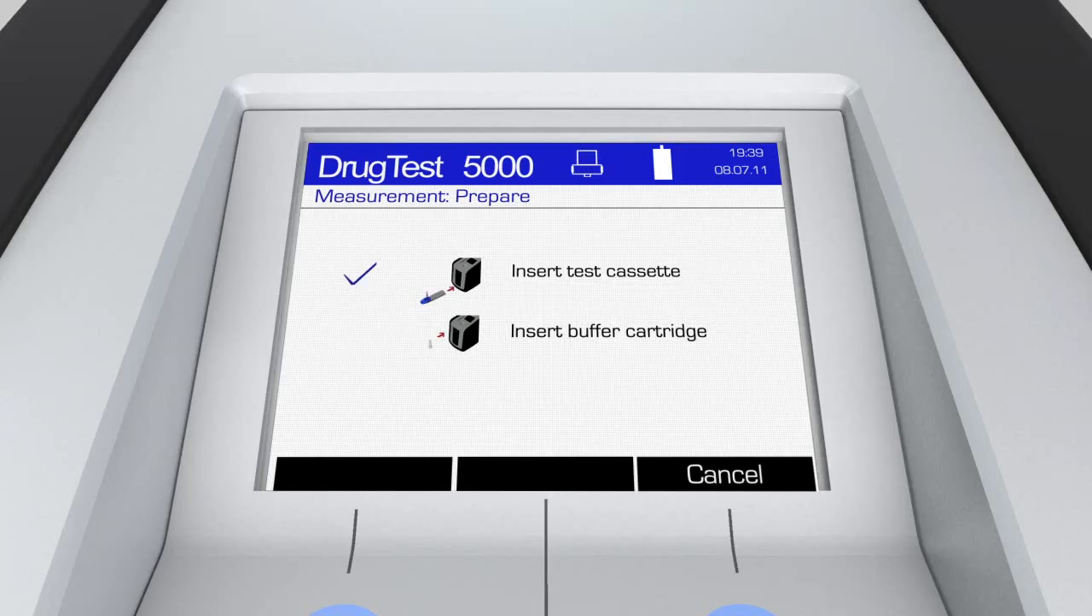Open the door of the analyzer and follow the simple instructions on the display. Slide the test cassette into the lower compartment until it audibly locks.